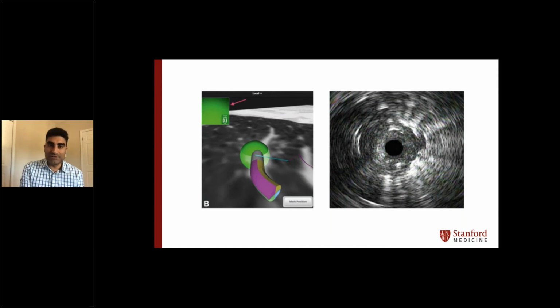But as we all know, there are some limitations with radial EBUS. It's more of a time checkpoint type of thing where you can go out there and make an assessment, but when you biopsy, it's kind of blind at that moment.